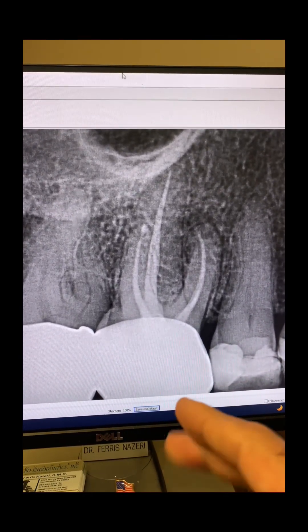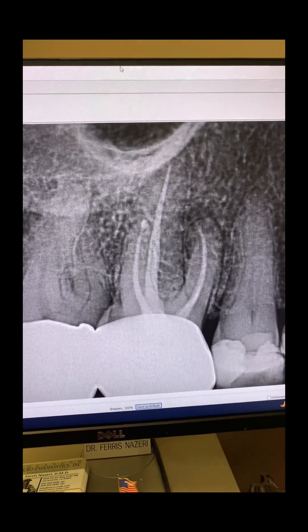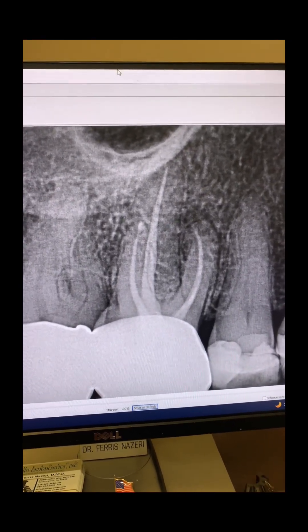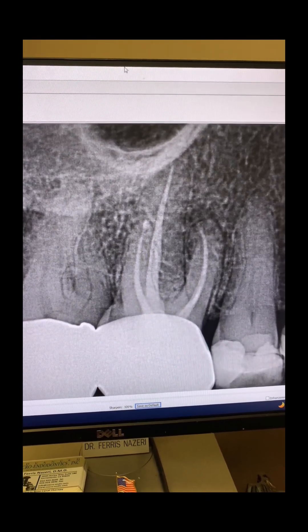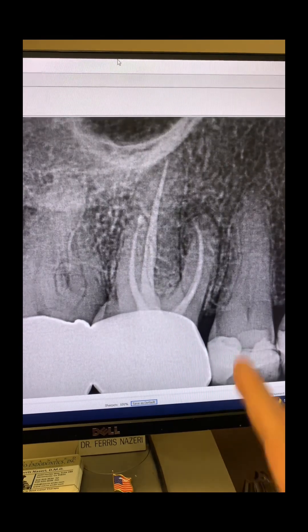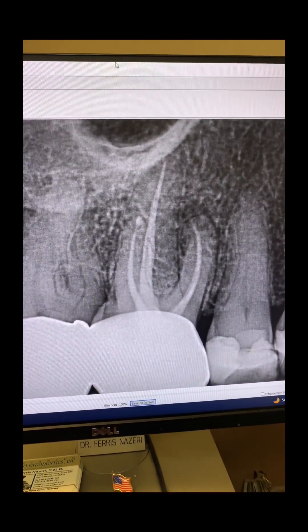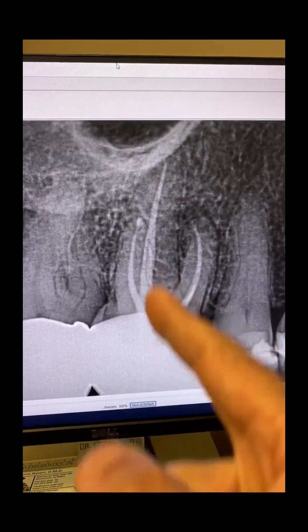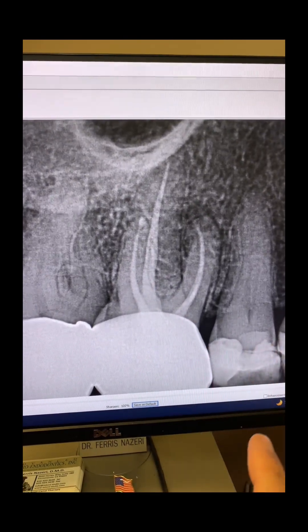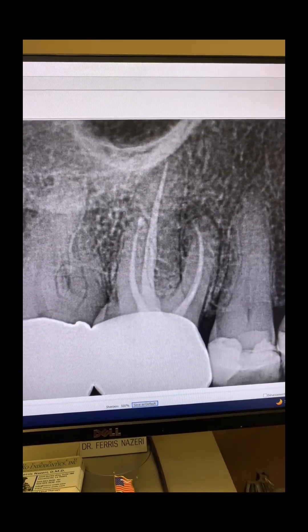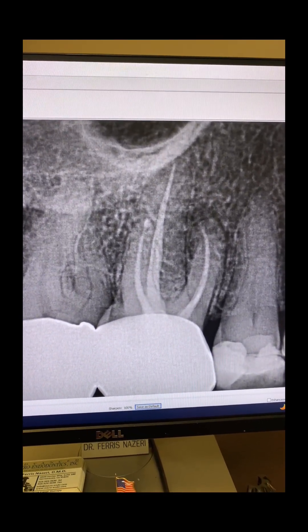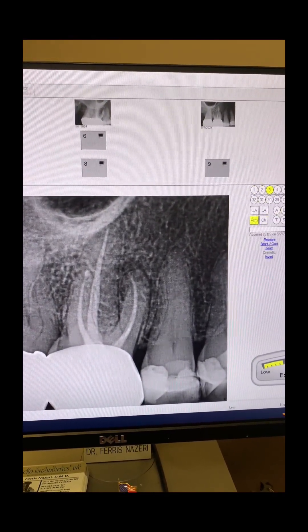I already know what the problem with this tooth is: there's a missed MB2. This endodontist missed the MB2 because the access was a ninja access — extremely small and conservative. That's why I don't recommend that clinicians make a ninja or extremely conservative endo access, because of situations like this. I modified the previous endo access, made it large enough to actually see the anatomy, and was able to redo this root canal in one appointment.